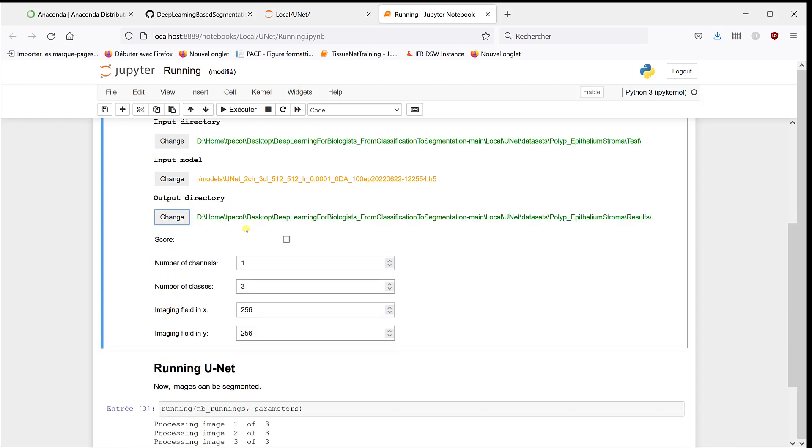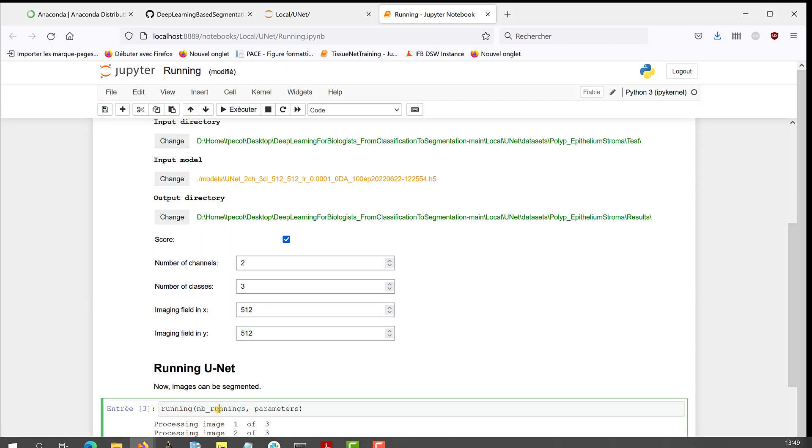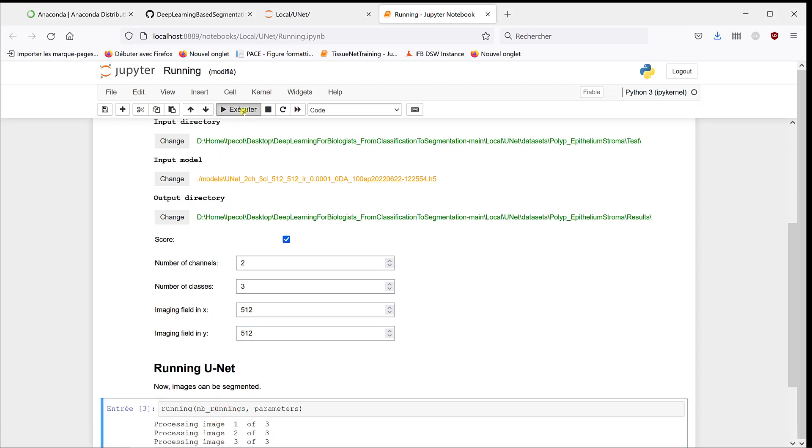And then we can either define the score for each pixel to get the maximum, and then the class that gives the maximum score. So we're going to start with the score, we'll understand how it works, and then we'll do the other one. So number of channels is two - DAPI and Cytokeratin - and the image field is 512 by 512. Now I can start the running.